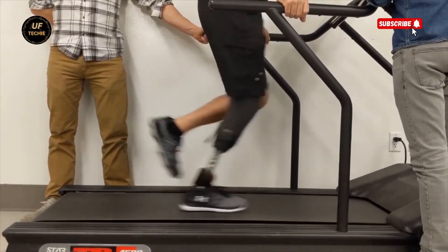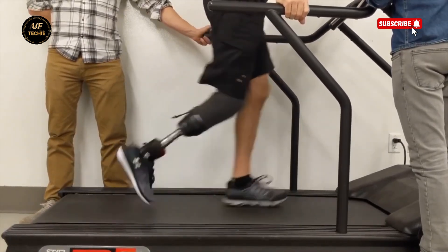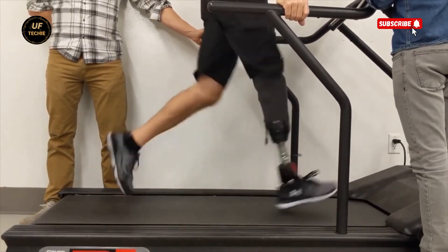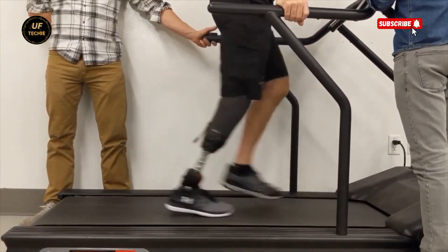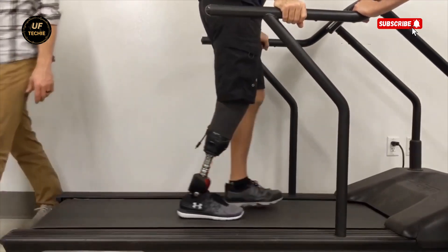This is more than a prosthetic. It's a symbol of freedom, resilience, and the power of technology to change lives. With Bionic M's robotic leg, users don't just walk again — they step forward into a new chapter of life with strength, pride, and independence.